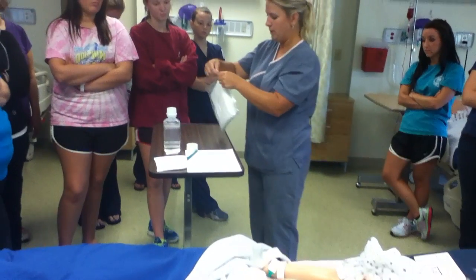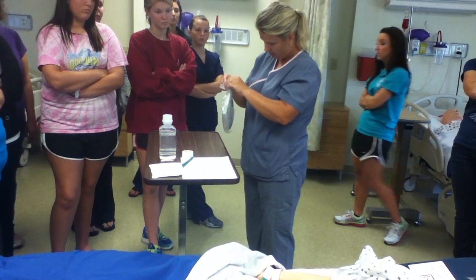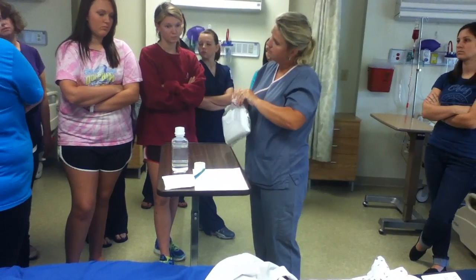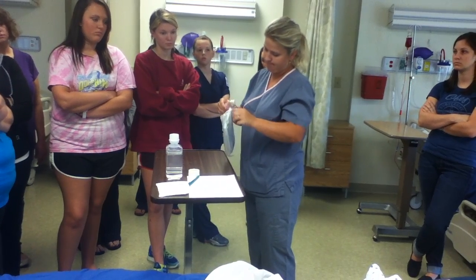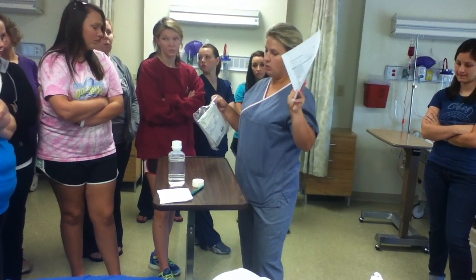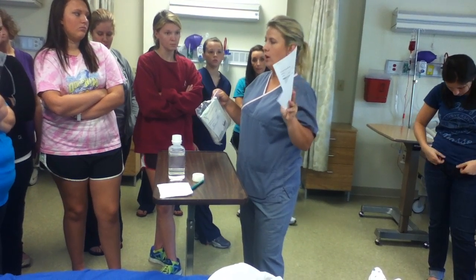I'm going to open up my sterile package. Let's see how these open. Are they perforated or do we pull them? So between removing the dirty dressing and applying the sterile fluid, you wouldn't perform hand hygiene? Just at one time. Go by your checkoff verbatim. This right here is what we use to check you off. So if you were following this for every item, there is no way you can go wrong.